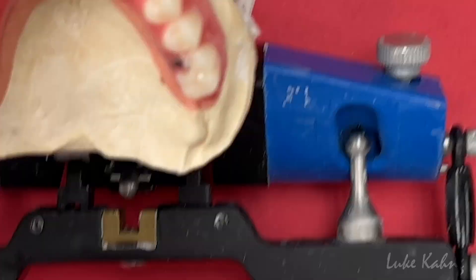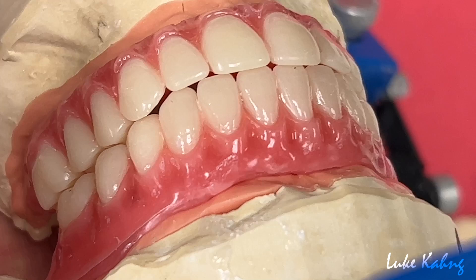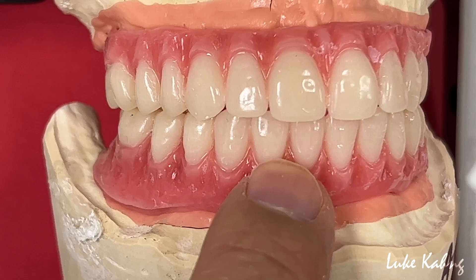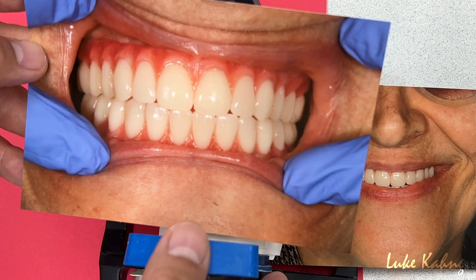When I saw the photo, it was bulky, so we tried to bring down everything. The wax-up is beautiful but the entire facial contours are too bulky, so I'm going to bring this in and also bring in this side as well. The doctor has to take smile photos, retracted photos, occlusion photos, and side photos. Once the case came back from the doctor's wax try-in, we reset the case because sometimes the midline is off and the tooth size is too long or too short.